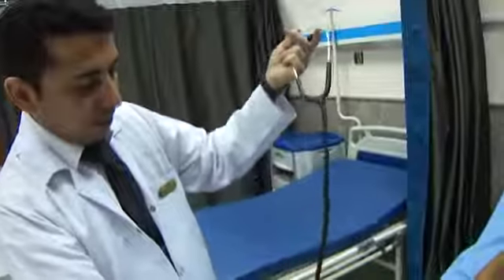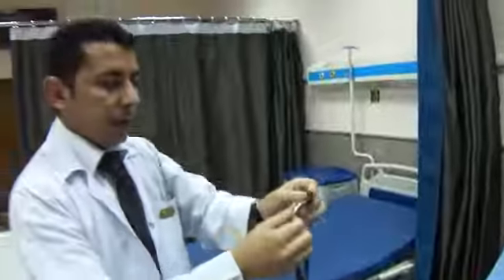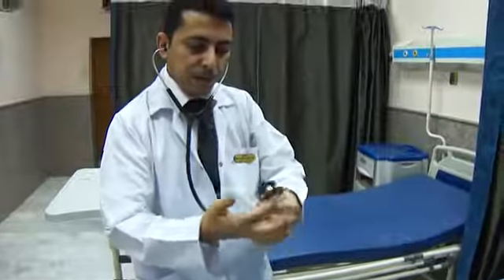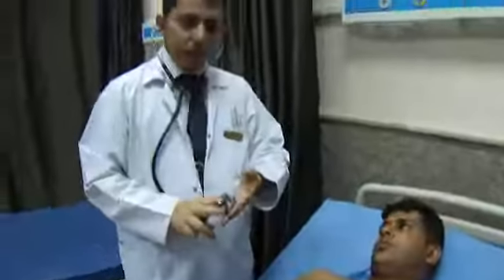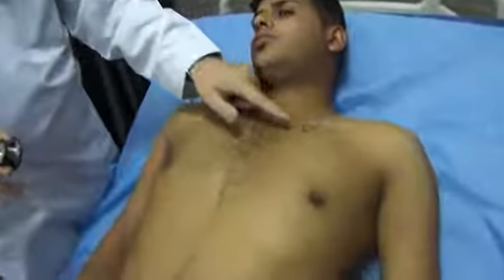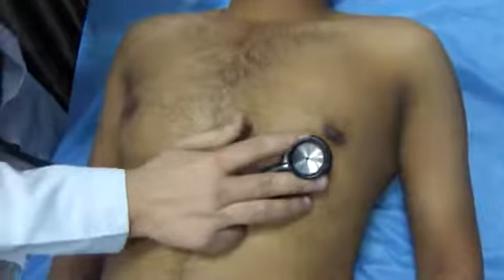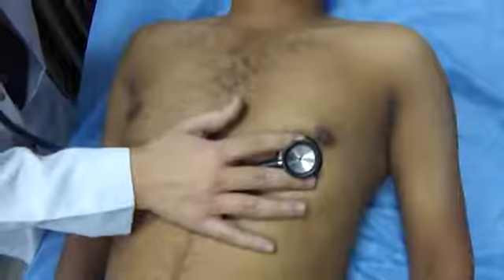Both tubes, or this single tube, should not have any tearing or cracking. In such a manner, I'll put the stethoscope here and check whether it is the diaphragm or the bell. I'll listen over the cardiac area, starting from the mitral area, then the tricuspid area, pulmonary area, and lastly the aortic area, asking the patient to hold the breathing if I hear any abnormality.